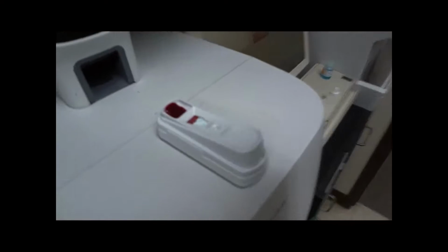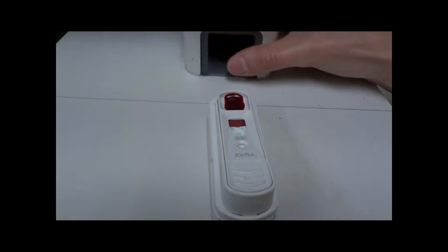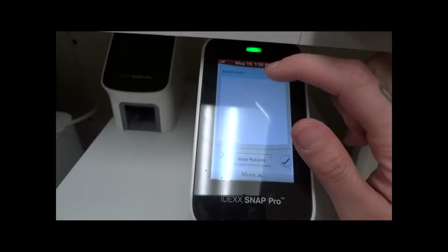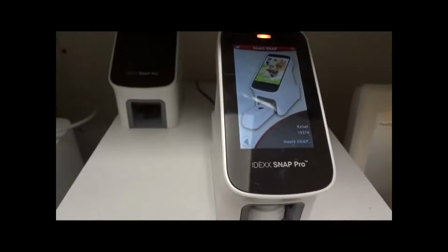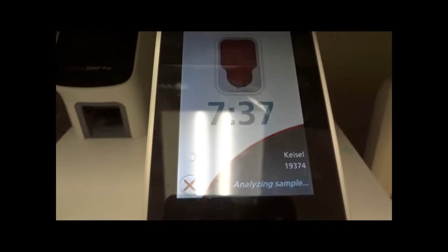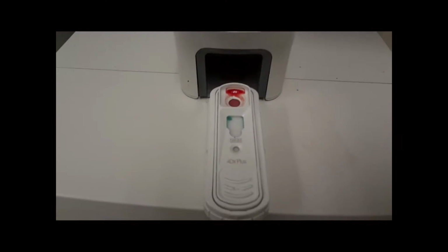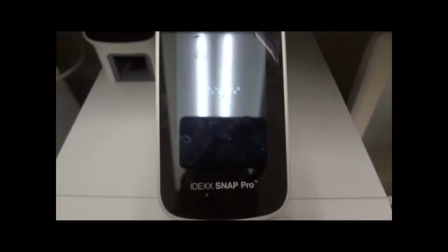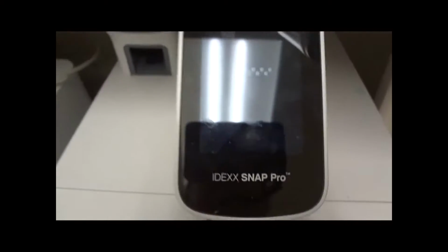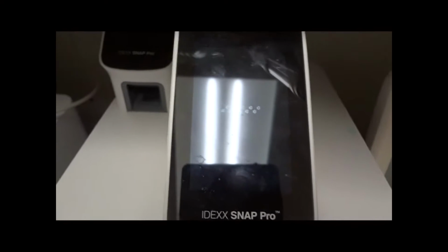Once the mixture of blood is in the snap test, you can see it's starting to come down. We will request the test on here and then insert into the machine. Incubation time is about 7 minutes, and the time has started to count down. Right, so our canine heartworm test is finished, and it did come back negative. The machine is still processing that, and it will pop up with the results. If it were positive, our machine also lets us know by beeping.